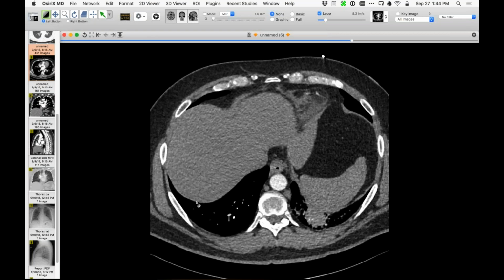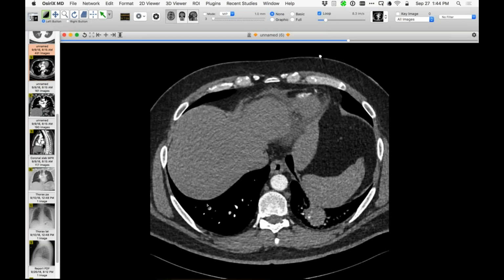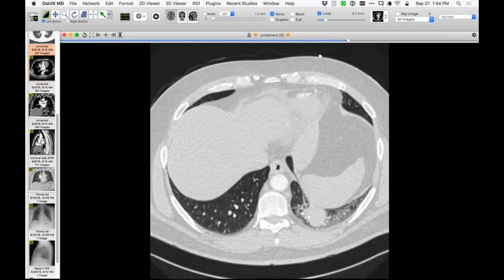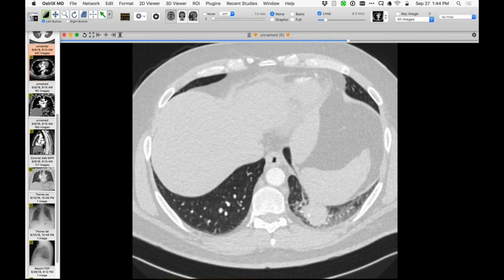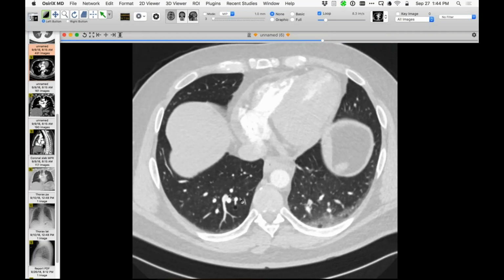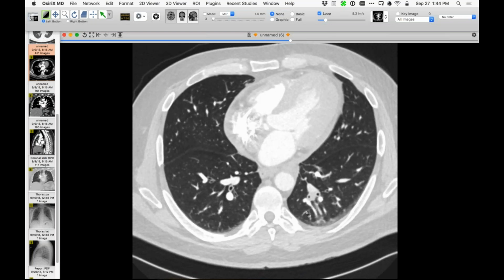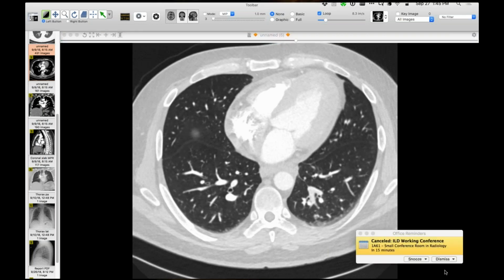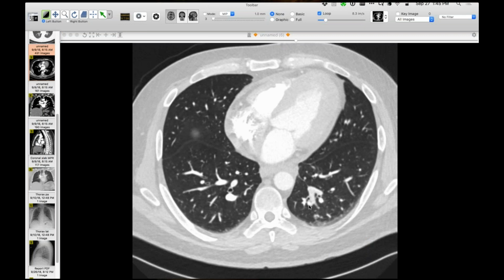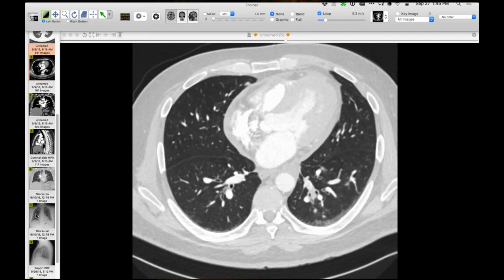You can see that there are some vessels that are undisturbed passing through the periphery of it. And if I mag it up a little bit and scroll around it, one hint as to why this is not a cancer is that there are a couple of airways that have slightly thickened walls, albeit just slightly. And some of the airways adjacent to it have material in their lumens. So that undoubtedly accounts for his symptoms, but not pulmonary embolism.